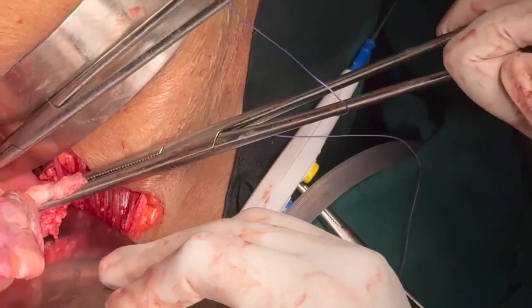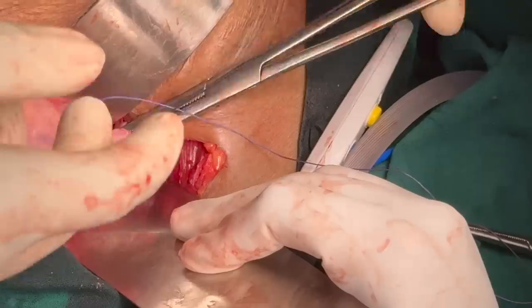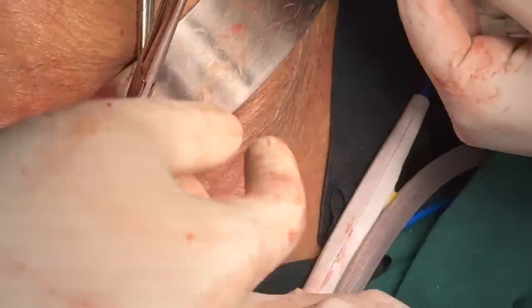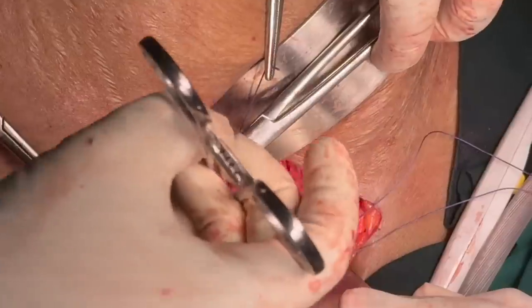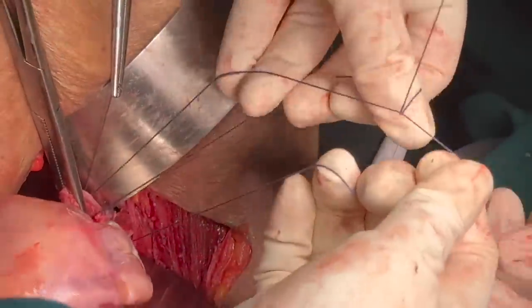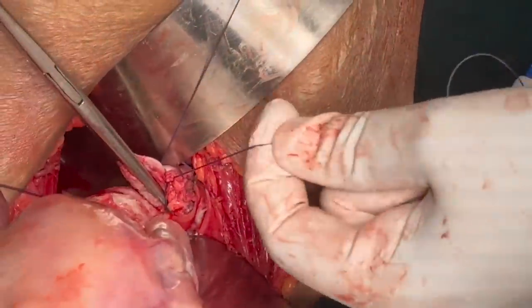Transfix it with vicryl number one — same transfixation suture — first bite at the tip, next bite at the junction of lower two-thirds and upper one-third. The suture should always come in the same direction: if the first time you passed the needle from posterior to anterior, the next time should also be posterior to anterior. For a transfixation suture the loop should come between the two metals — the first metal being the clamp and the second being the needle. If you follow this, your loop will fall exactly where it should and make a nice secure knot.